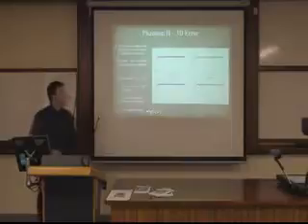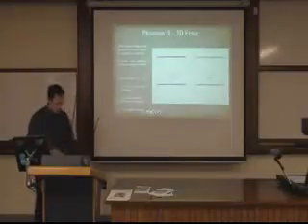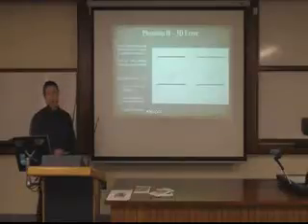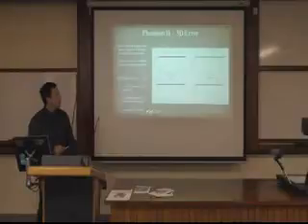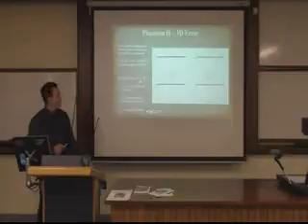And so for Phantom 2, that was the clinically more significant one. I had more results, but I'm only showing a few here, because they're actually all pretty much the same. You just see the same pattern over and over. And so, for marker 1, marker 2, marker 3, marker 4, this time, because this is not independently measured, each point is the average of all the data minus the location of that individual point. And again, you see very sub-millimetre differences.